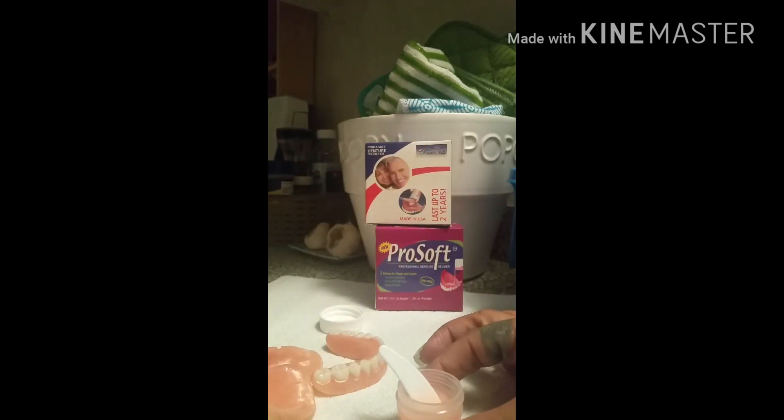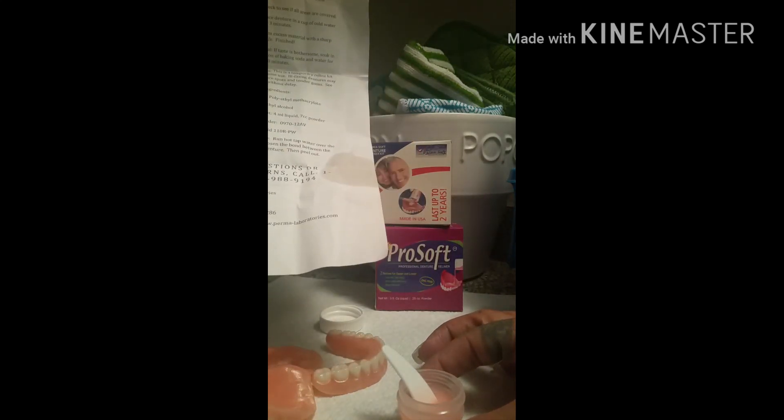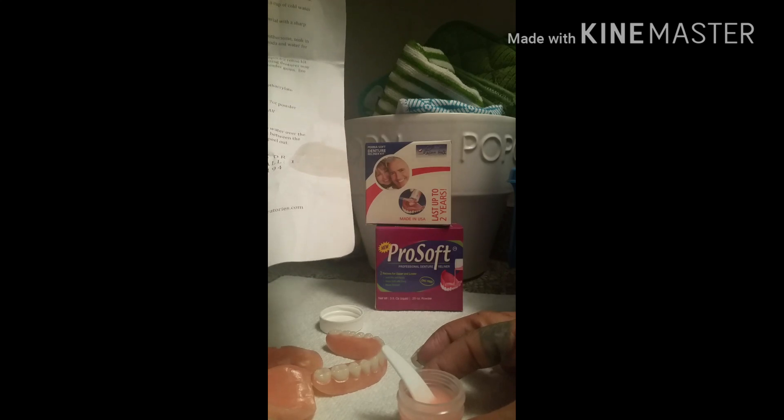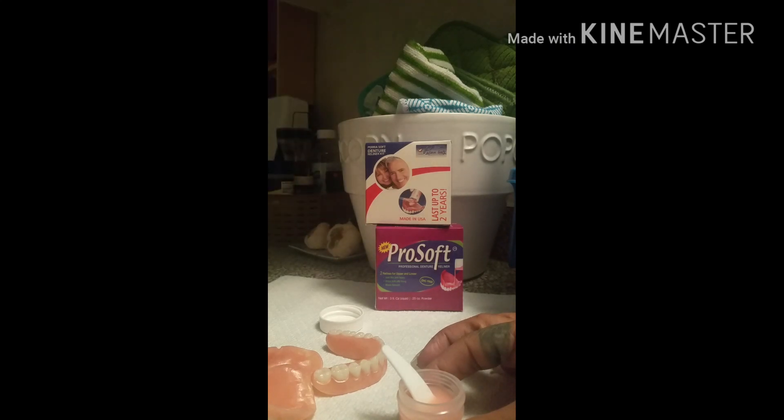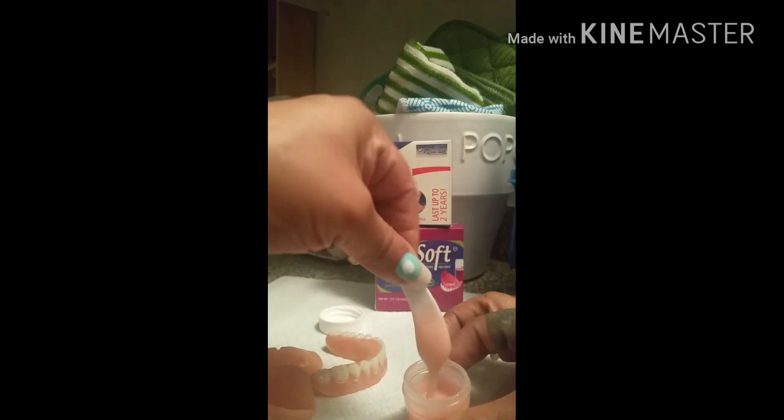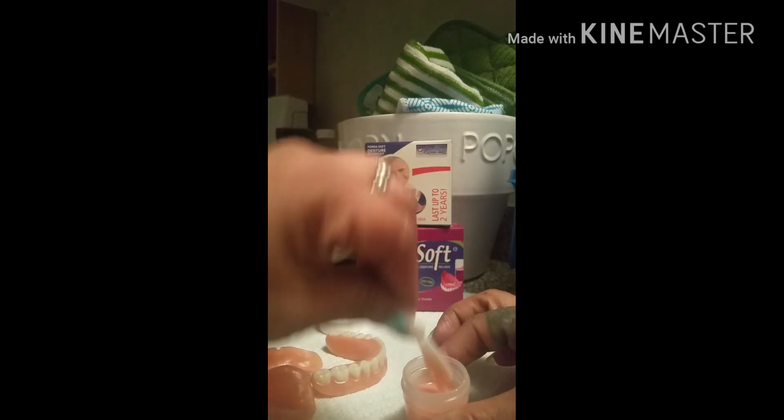It says right here: rinse your mouth with water and insert the denture into your mouth, bite down for three minutes — this will take the impression of your gums. That's what we're going to do. I'm going to pour it in now. You can actually feel the change in the liquid as it sets — nice!